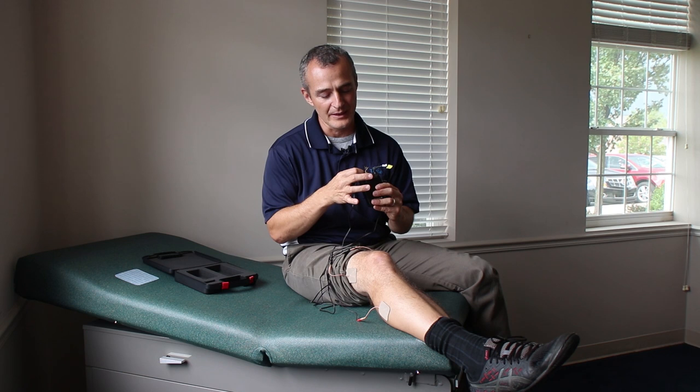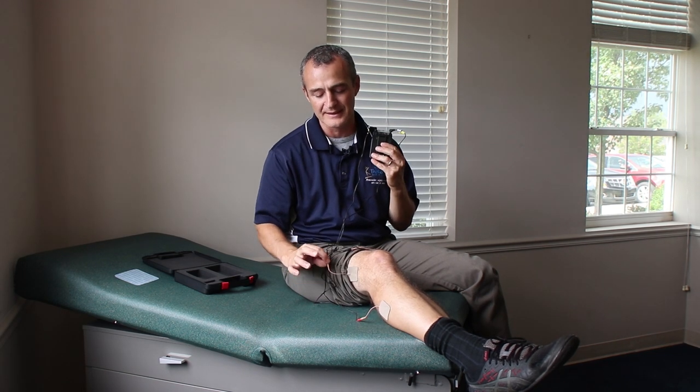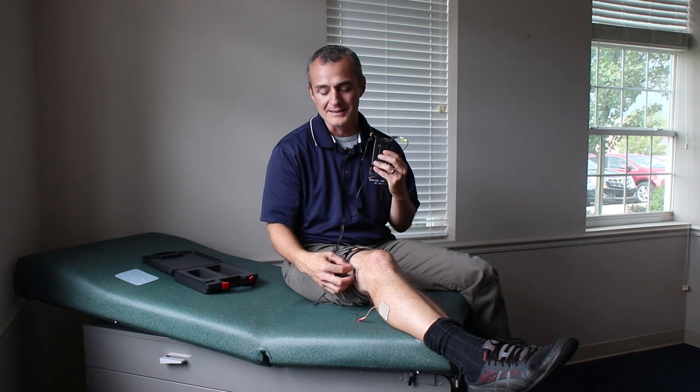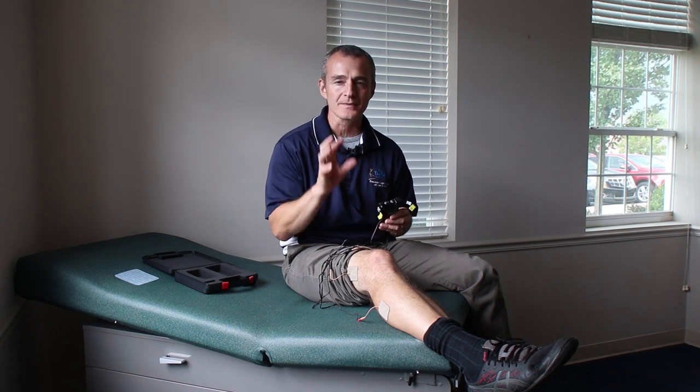Once I hit about number two or two and a half, I can feel just a little bit of buzzing on the outside of my leg. I feel it more strongly above the knee than below, but that doesn't mean I'm not getting the same electrical signal — it's just a little more sensitive up there. You want to turn the intensity up to a point where it's strong but comfortable. There is no need for the muscle to twitch or pulse. If your muscle starts to jump, just turn the intensity back down a little bit. I'm looking for a strong but comfortable level of intensity.